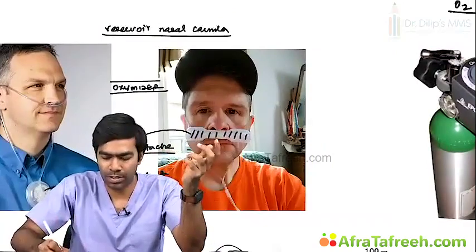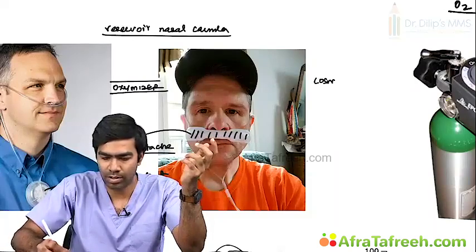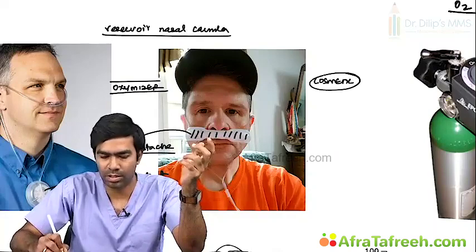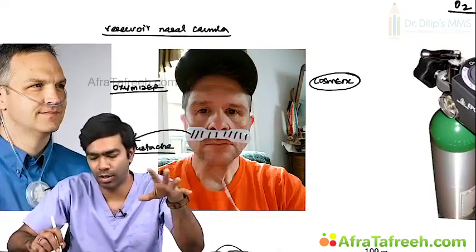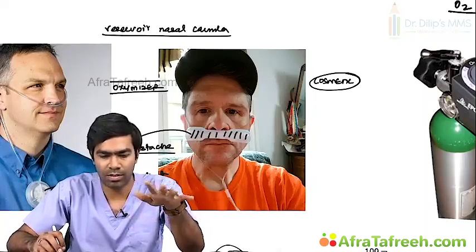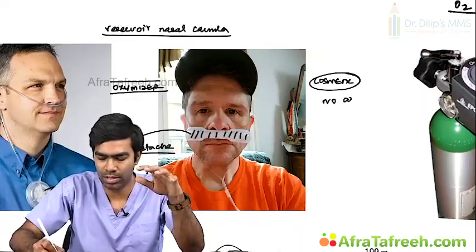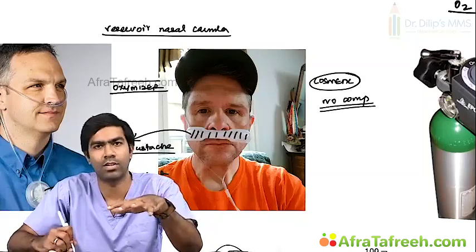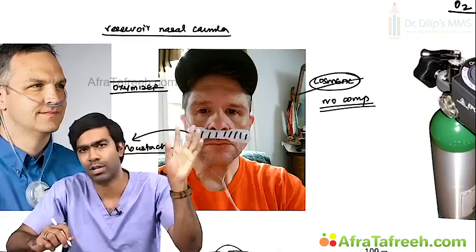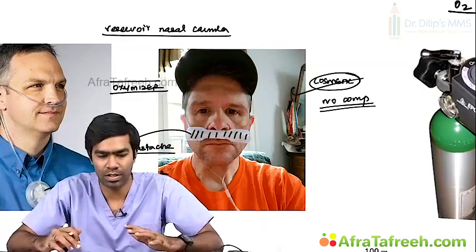But the problem is cosmetics. They are very ugly looking and patients don't like it at all. Cosmetically, it is obtrusive and disfiguring. So they don't like it at all. Comfort wise, it's not a problem at all. It is adequate and there are no complications at all. There are absolutely no complications like transtracheal catheters and all. Cosmetic is the only problem for many of the patients. You can achieve high flows also in this. Efficiency is also very good.